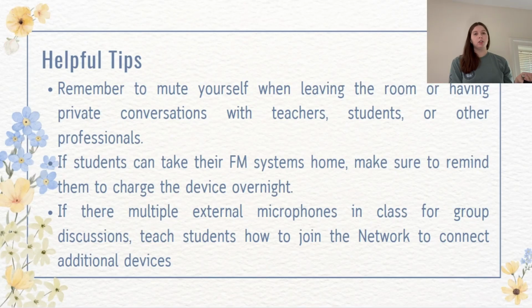Even if you leave the classroom and are standing behind like a wall, the student will still be able to hear you, so please be aware of that. You can leave the FM system in the classroom on your desk, but just be sure that it's muted in case you're going to the bathroom or something or having a really important conversation.